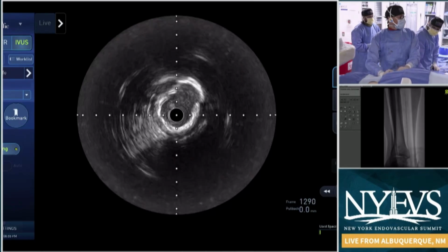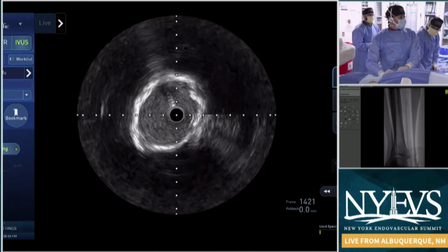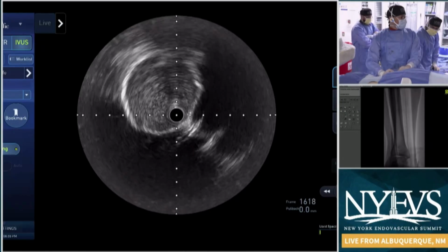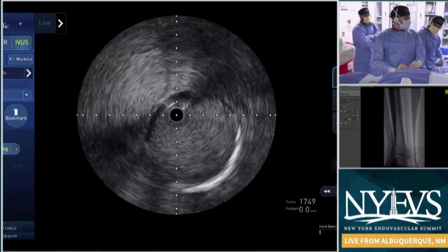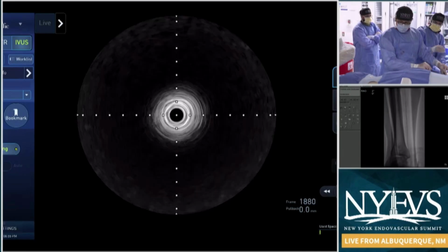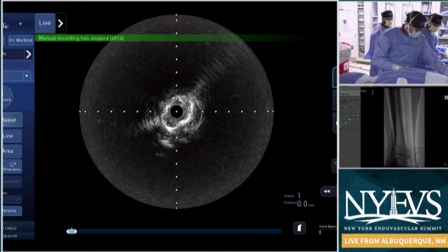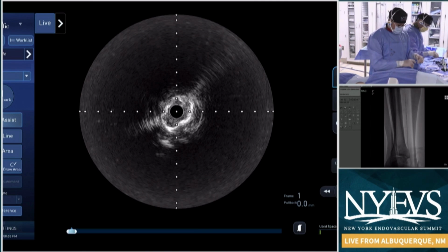Early operators always ask, what if I'm predominantly intraluminal, but I had a short segment of subintimal crossing, especially in tibial vessels, and in the use of atherectomy in terms of orbital atherectomy and so forth. I know Jihad, Mustafa, and Fadi have shown that typically, if you have just short segments of subintimal crossing, orbital atherectomy is pretty safe. It just ends up creating a bigger channel through that area. Obviously, the risk is that the device can get stuck, so you have to be very careful in terms of wrapping.